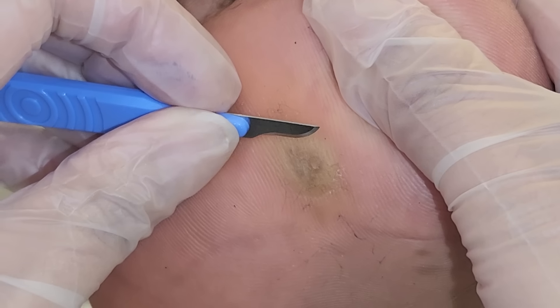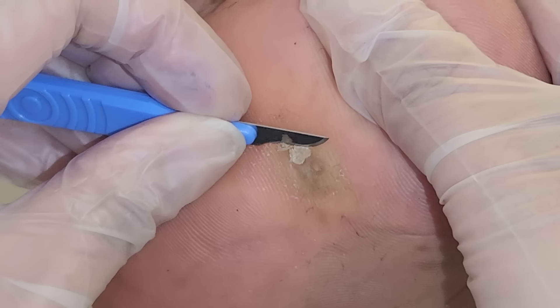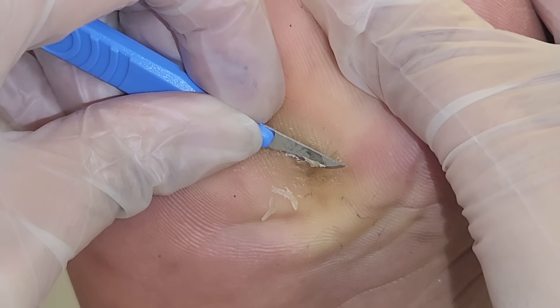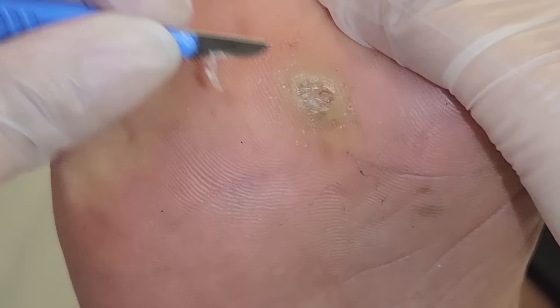So what we're going to do is I'm just going to scrape it back first, and it's really, really painful. What kind of treatment have you used for it? Some gel. Some gels, okay. And did it help? Yeah, a little bit, but it got painful for a while.